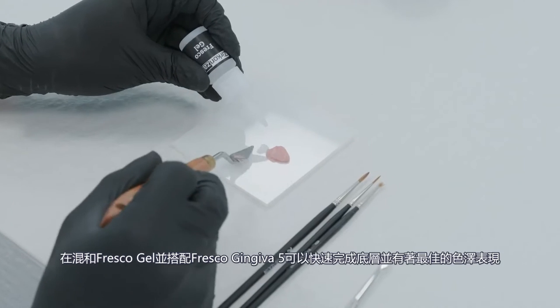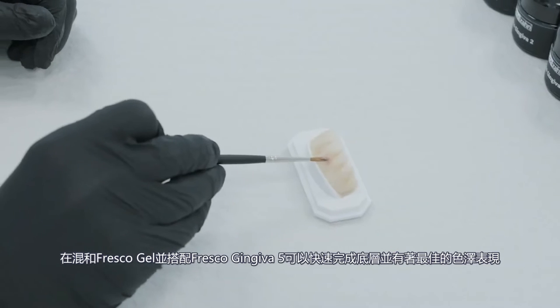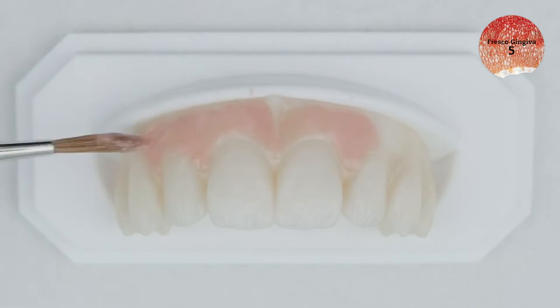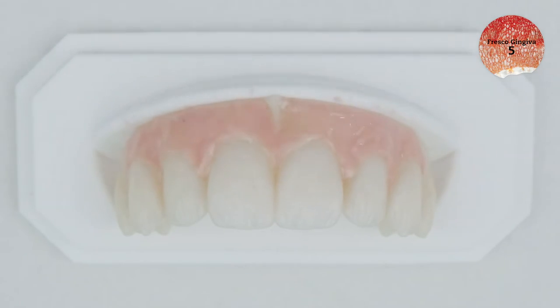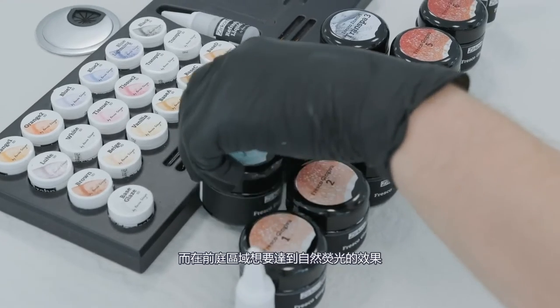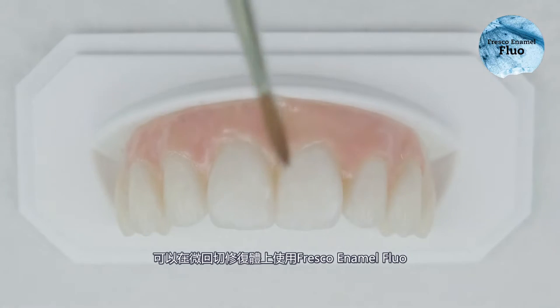After mixing with Fresco Gel, you can quickly apply a base layer of Fresco Gingiva 5 to create an optimal color base for natural fluorescence. In the vestibular region, you can add Fresco Enamel Fluo to the minimally reduced structure.